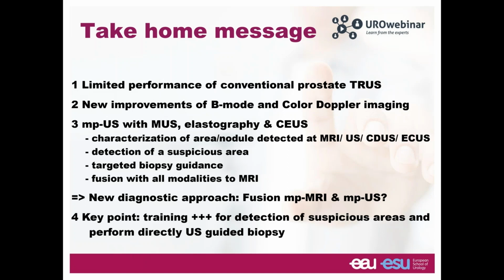The next tools could be elastography and contrast-enhanced ultrasound. And this can be applied for characterization of an area or nodule detected at MRI, ultrasound, color Doppler, or contrast-enhanced ultrasound, detection of suspicious areas, targeting biopsy for detection and staging of prostate cancer, and fusion with all modalities to MR.